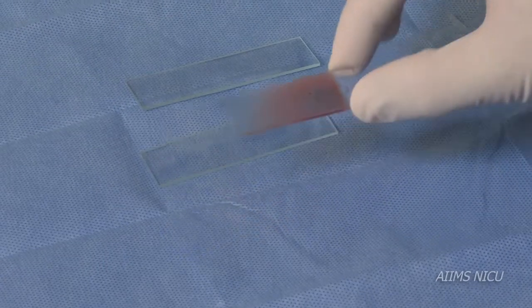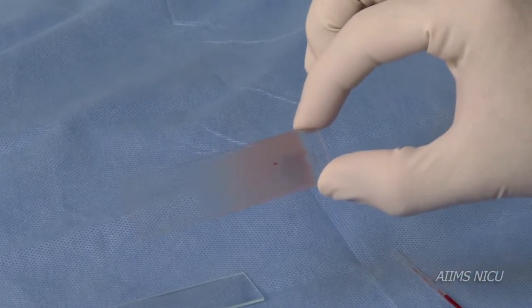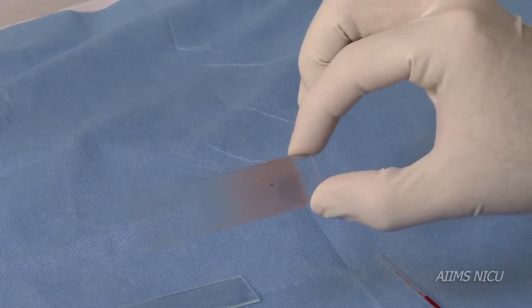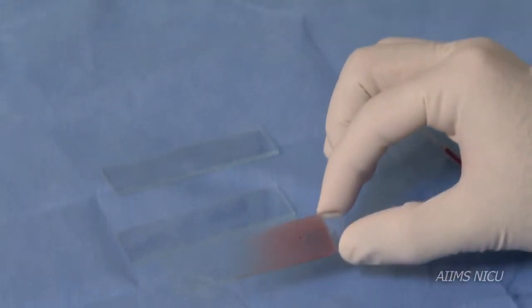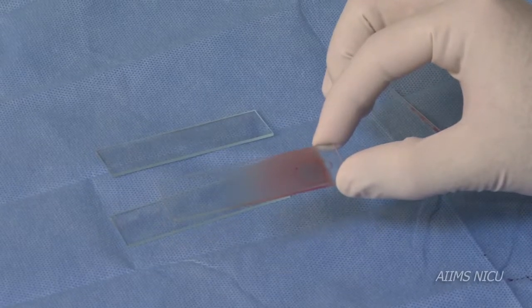A good peripheral smear will be tongue-shaped with a smooth tail. It does not cover the entire area of the slide, and has both thick and thin areas with a gradual transition and no lines or holes.